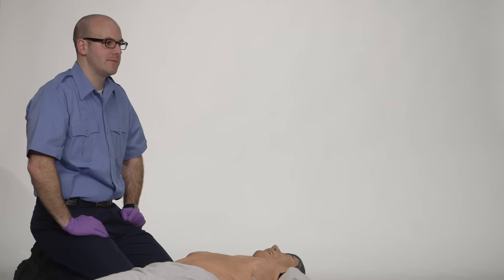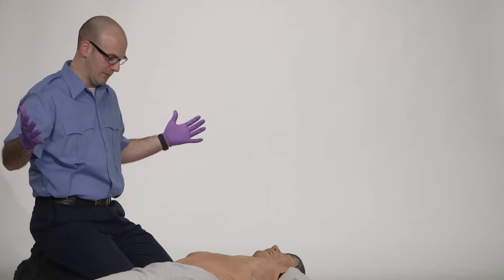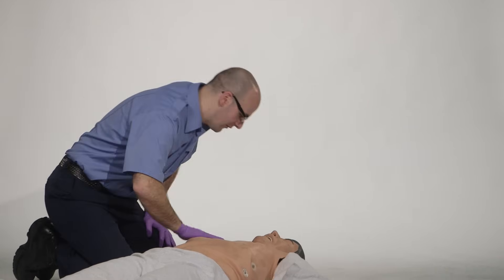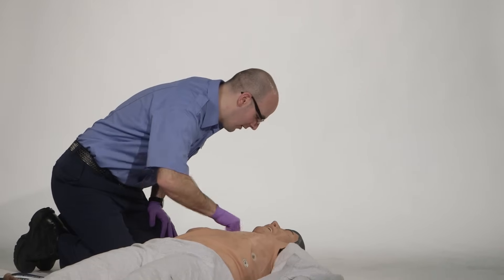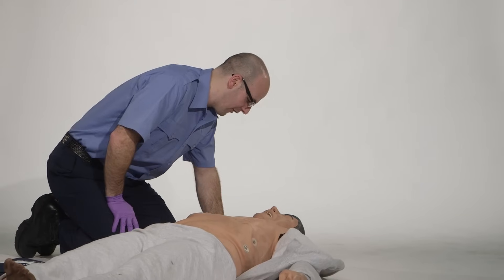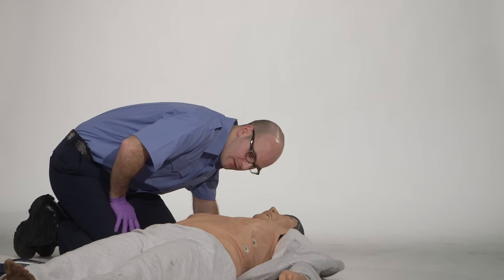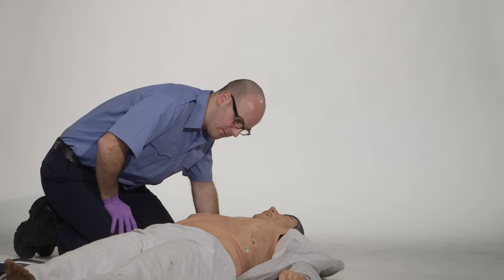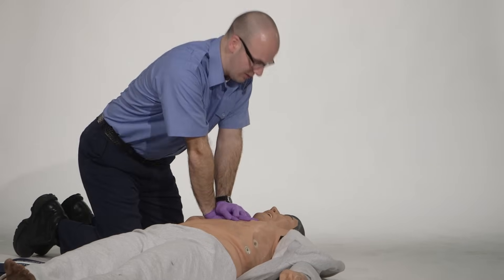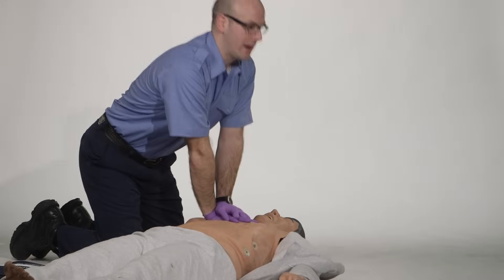BSI — is my scene safe? Your scene is safe. Do I have anybody around that can tell me what's going on with this patient? There's nobody else around. I'll assess level of consciousness. Sir? Sir? Sir? The patient is unresponsive. I'll check for a pulse and see if he's breathing. The patient is not breathing and the patient is pulseless.